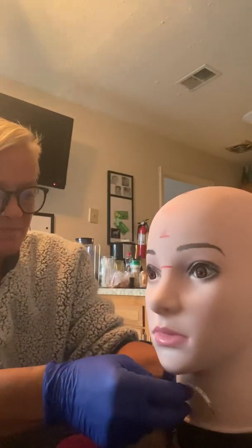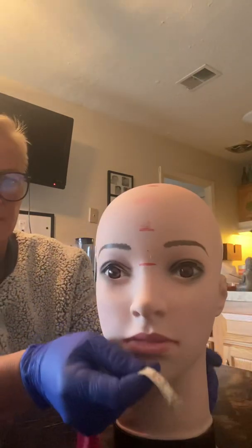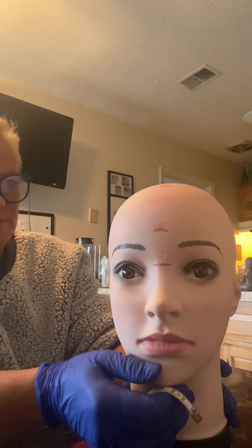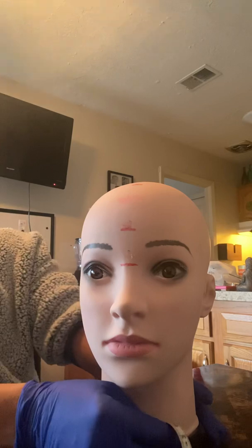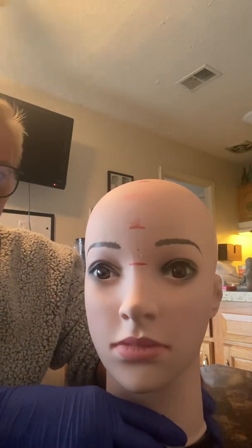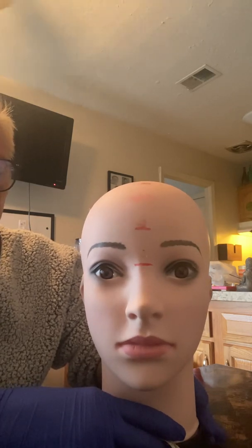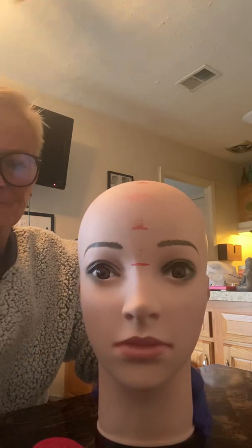Sometimes your measurement might be off a little bit because lifting the tape measure can shift it slightly. The more accurate you are in measuring and keeping that tape measure flush, the better. Also, sometimes people's heads are a little different — not everybody is symmetrical. You may run into people who have scars or surgical scars and things like that. So that's step one and step two. Thank you very much.